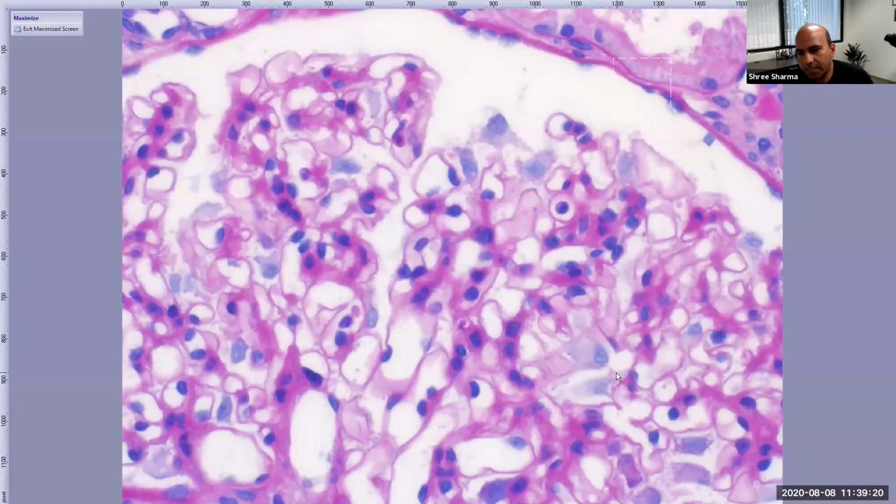We are dealing with podocytopathy, so something is going wrong with the podocytes. In some variants of FSGS you will see reactive podocytes, reacting because they're abnormal, so you see very prominent podocytes. You're not seeing any other proliferation. They are reactive podocytes, in a different plane, a different type of cell. That's why they are staining differently.